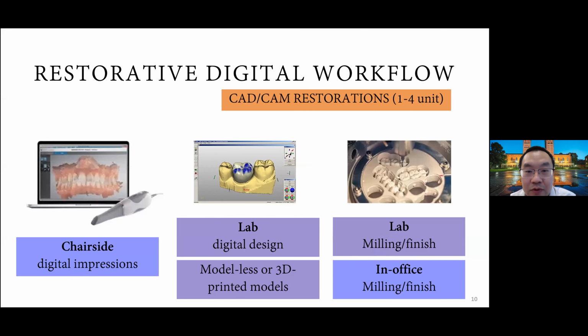So of course we have the restorative digital workflow, which is talking about CAD/CAM restorations from a single unit up to a bridge, usually about 3 to 4 units, right? So you have the chairside digital impressions, right? And then you're able to scan over to a lab. The lab is able to design that, right, based on the lab software. And you can actually do this in your office too.